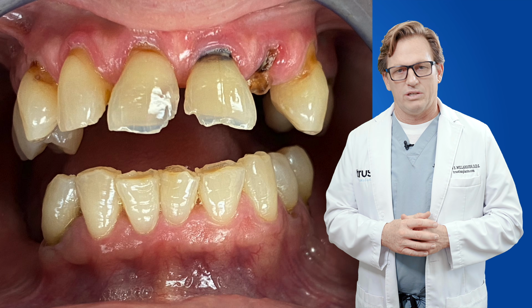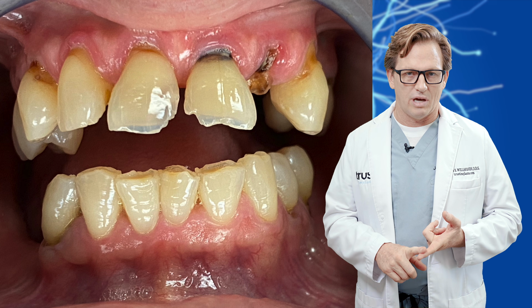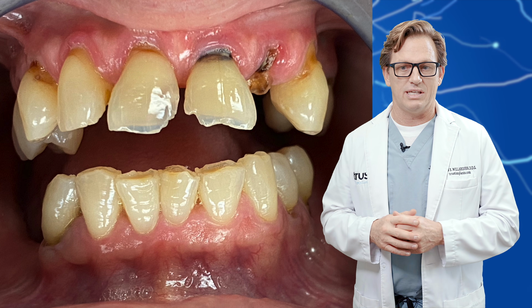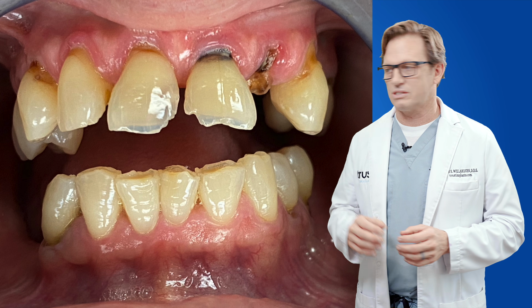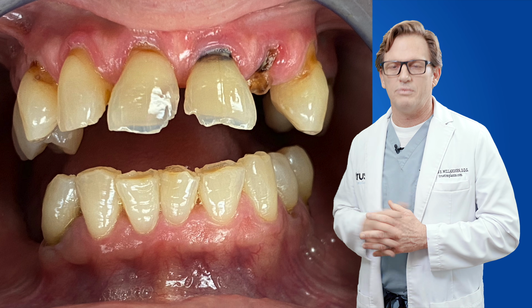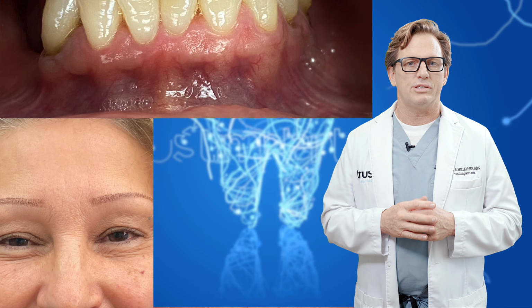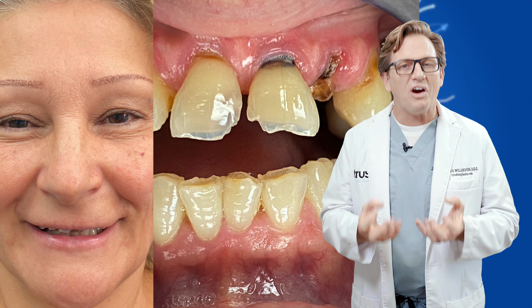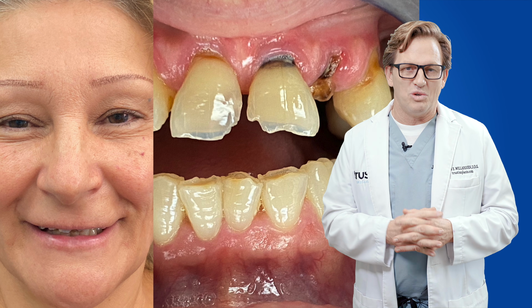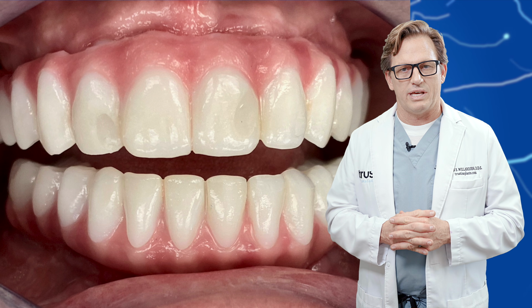Now let's take a look at this other case. Similar situation. She's got periodontal disease, not as bad as the first case, decay, but this is an absolute case of biomechanics. If you look at this photo, you can see the wear and tear of her front teeth. Because she's lost her molars, those teeth have just worn down, and they've worked hard to try to get her through normal natural function of chewing and eating, but now they're just like, okay, I give up, and they want out.